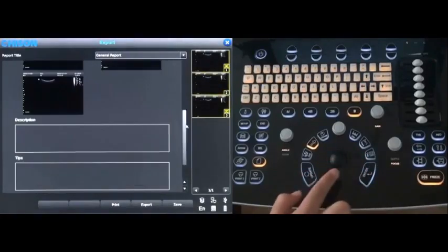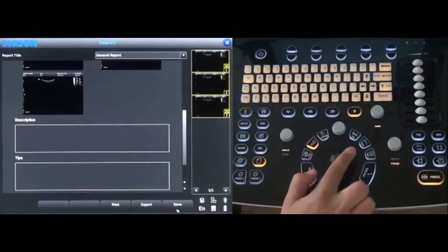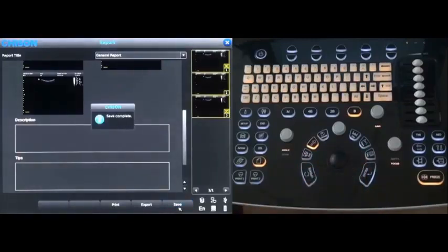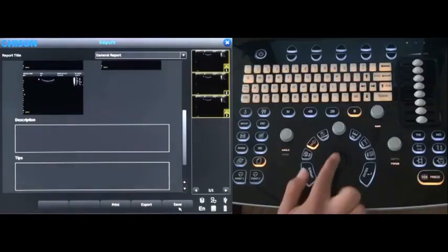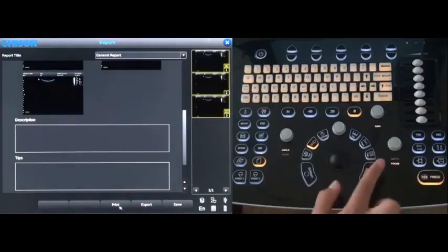Then press save. Press the print key, you can print out the report.